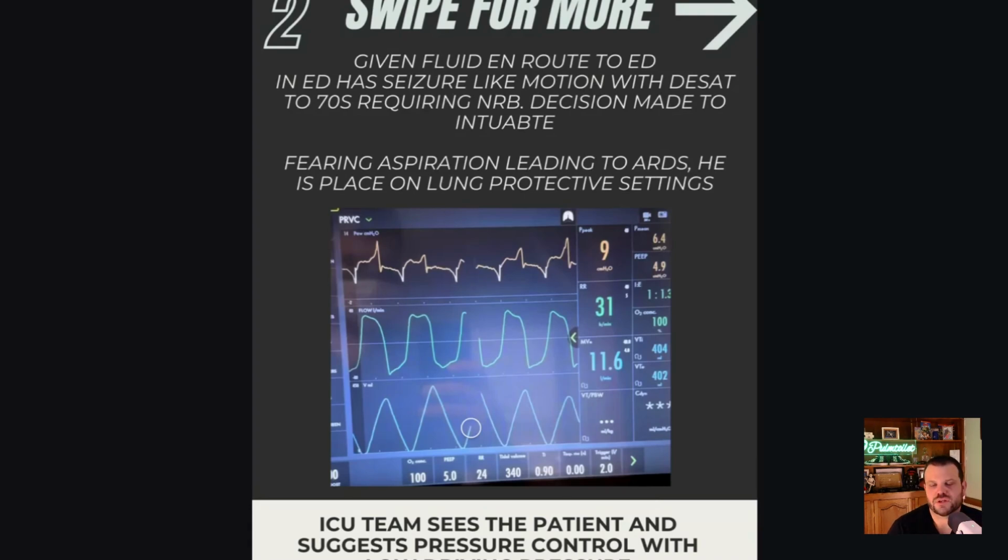I think the issue, from some online discussion, is that if the patient has acidosis or severe metabolic derangements and you have to intubate the patient for some reason, even though we try to avoid that because intubating doesn't really fix the problem and ultimately leads to probably more problems, in some situations you need to do that for whatever reason: altered mental status, aspiration, whatever the cause is. And there's this presumption that you have to go above and beyond what you can with the mechanical properties of the lung, let's say, for a passive patient. Now, for an active patient, I think it's a little bit different. In this situation, the patient's active, and overall what we'll discuss is the active patient.